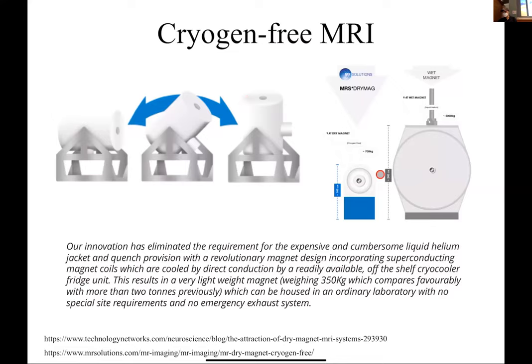And the other advantage is it's much smaller. So this cryogen-free one is for looking at small animals, so it's not for humans. And then this is the similar size. So see, the bore size is the same, right? The size of the object you can put in is the same, but this is the one that has a lot of liquid helium in it, whereas this one does not. Okay. How all these work, I don't know yet. These are relatively new, but it is a trend.